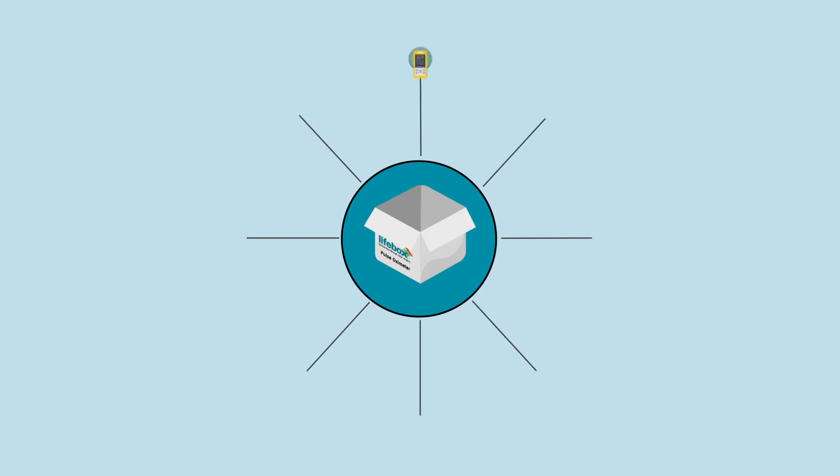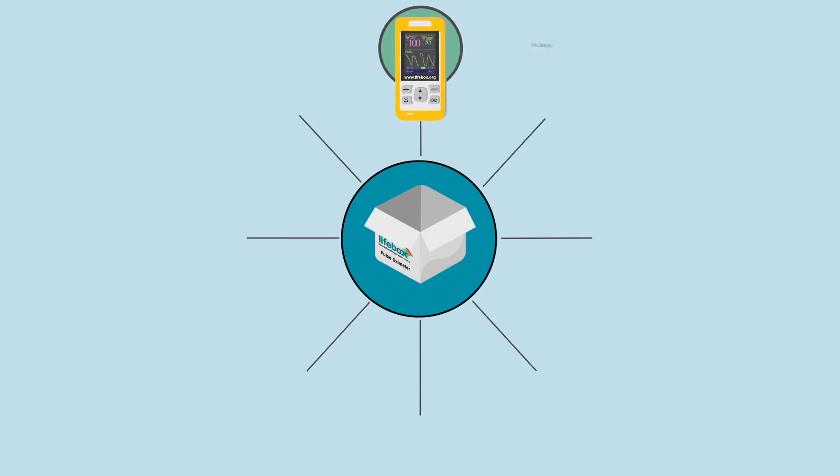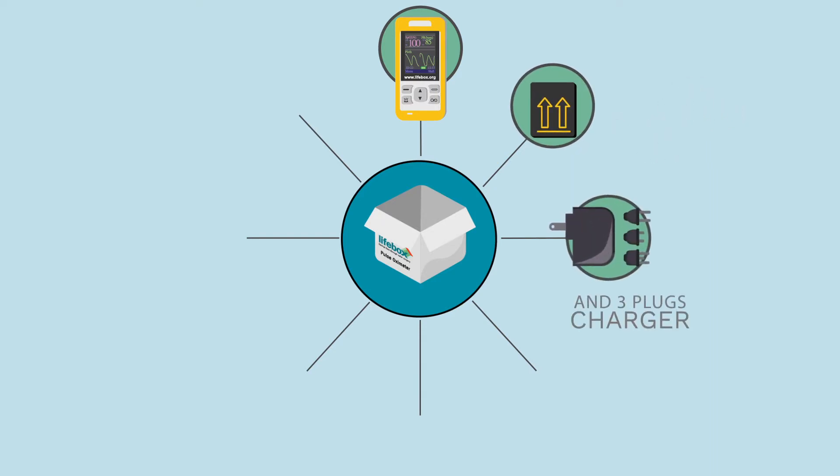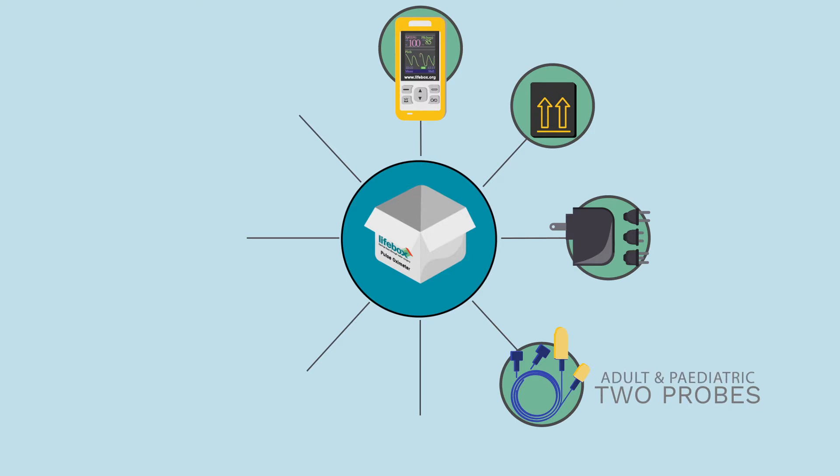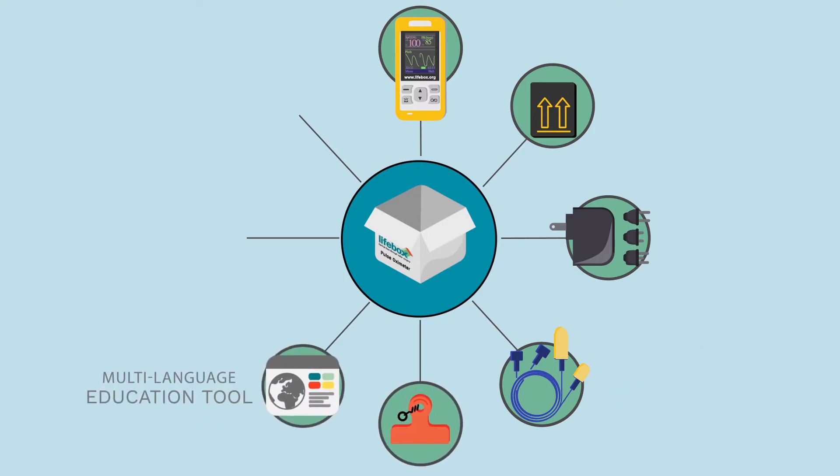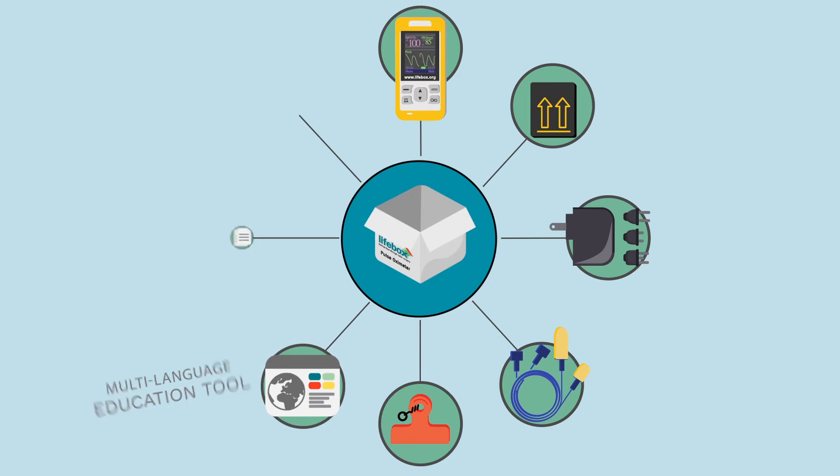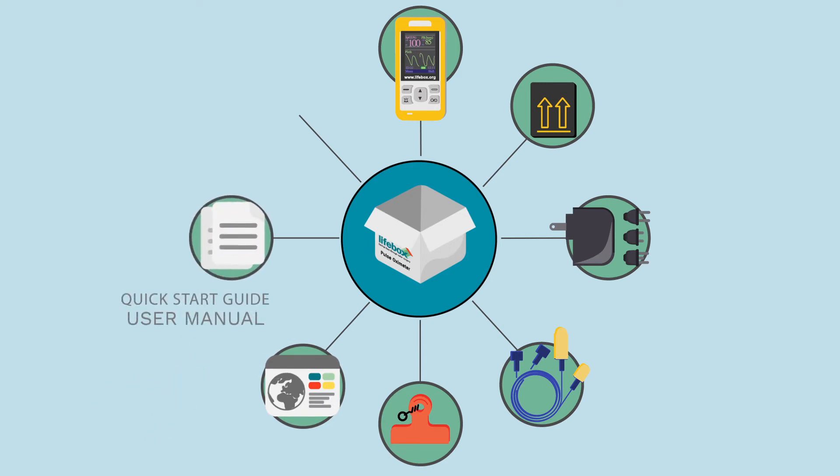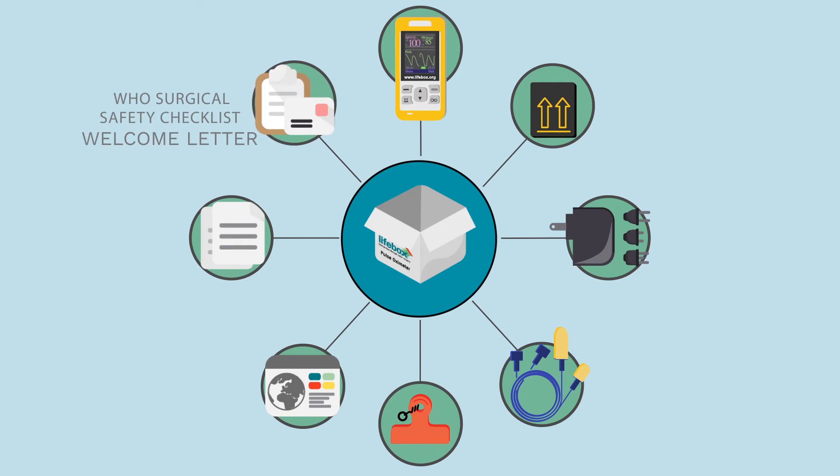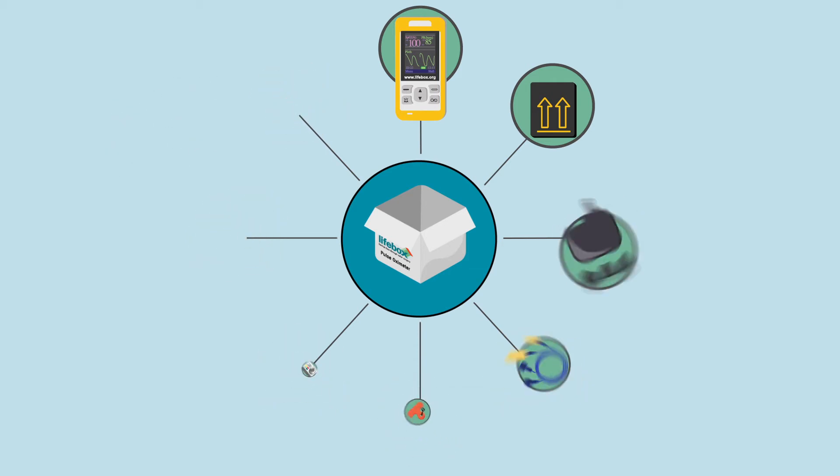You will have an oximeter in a yellow protective cover, a rechargeable battery, a charger and three different plug types, two probes (one adult and one paediatric), a pillow clip, a multi-language education tool, a user manual and quick start guide, and a welcome letter with a copy of the WHO's surgical safety checklist.